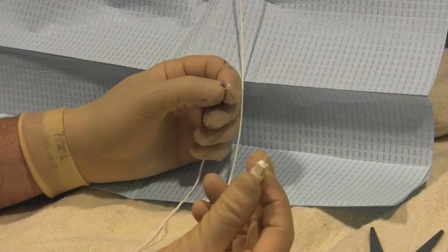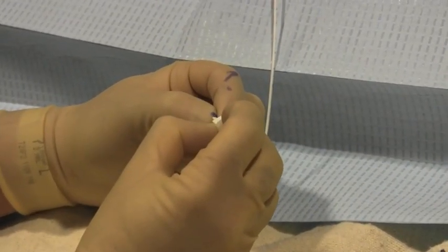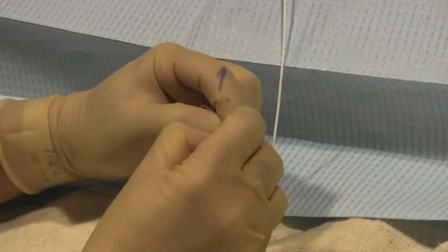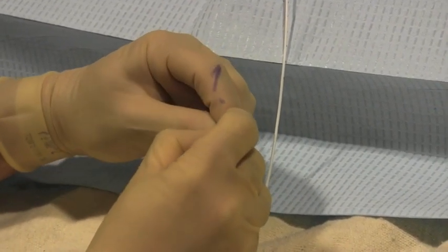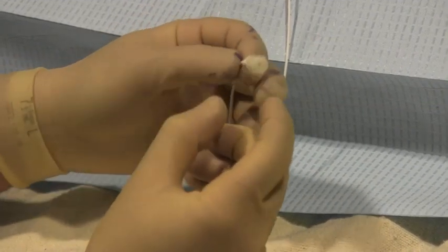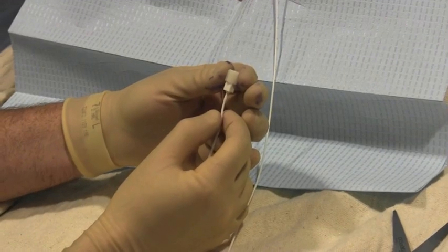A cap is now inserted on the end of the lumbar drain catheter. This cap will be secured with a small suture tie.